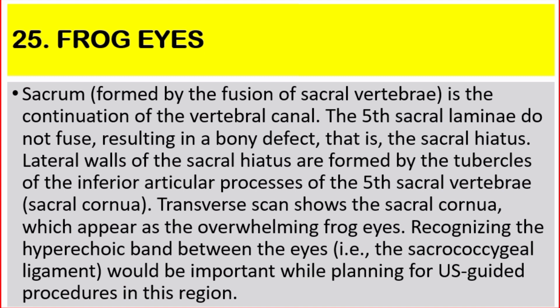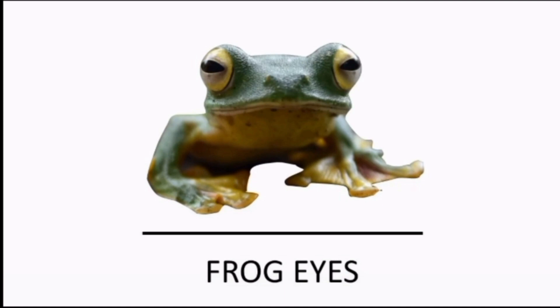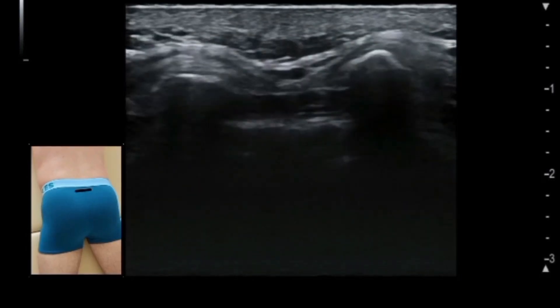Number 25: Frog Eyes. The sacrum, formed by the fusion of sacral vertebrae, is a continuation of the vertebral canal. The fifth sacral lamina does not fuse, resulting in a bony defect that is the sacral hiatus. The lateral walls of the sacral hiatus are formed by the tubercles of the inferior articular processes of the fifth sacral vertebra, called the sacral cornua. Transverse scan shows the sacral cornua appearing as frog eyes, and recognizing the hyperechoic band between them, the sacrococcygeal ligament, is important for planning ultrasound-guided procedures in this region.